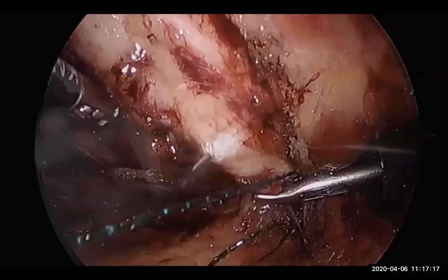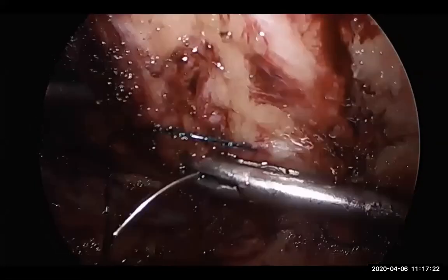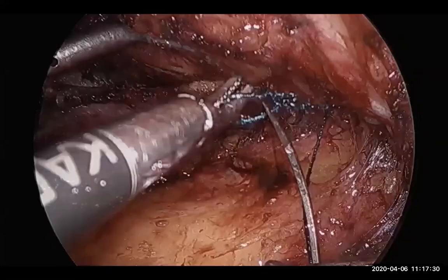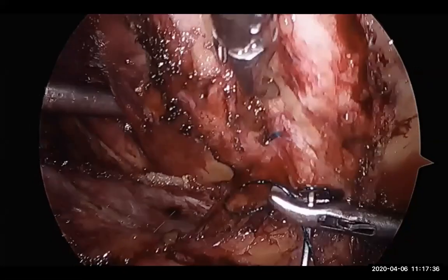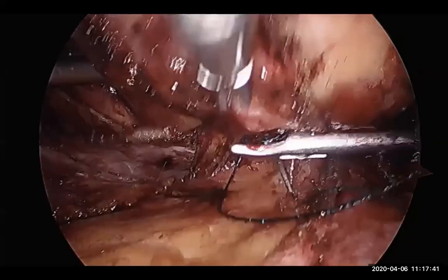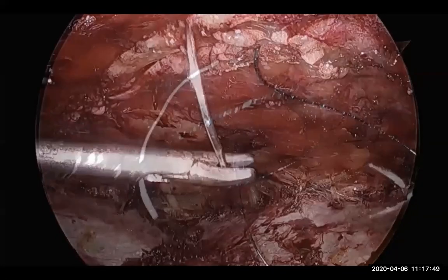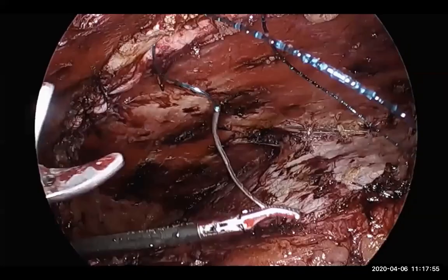So this is now bite on the upper part of the linea alba, subxiphoid, and now coming down. So you have to start from below up and then from above down. So you can see that we are looking from below up. That is the area of the xiphoid. That is the first two bites. And typically, I would place a port on the opposite side, which means this would be the second contralateral port. So I would have bilateral instruments and triangulation.